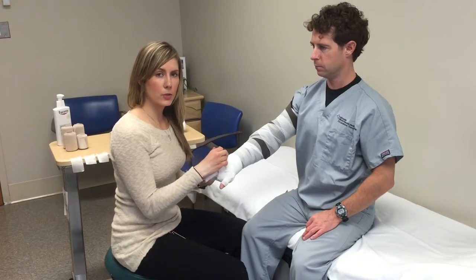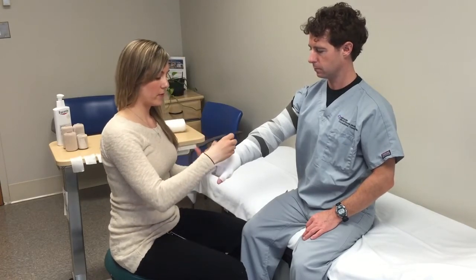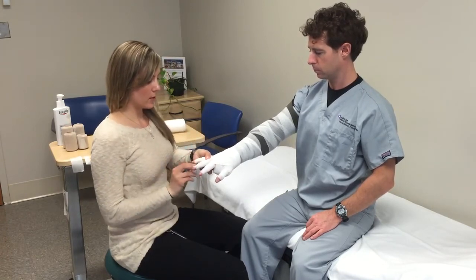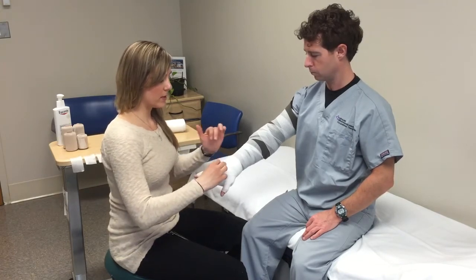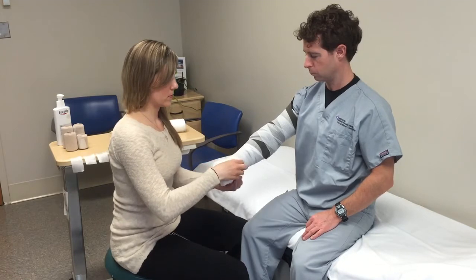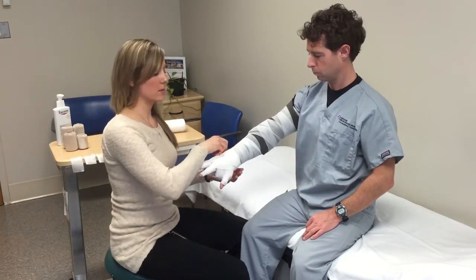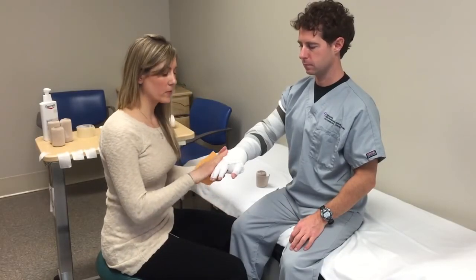Most hands will require at least two finger wraps. I've finished the fingers but I still feel like I need to reinforce between the fingers so that when the patient makes a fist there isn't a lot of skin showing. I'll go around until that area is fully covered. Now that the hand is complete, we've made sure it's comfortable and there's no skin showing when the patient makes a fist.